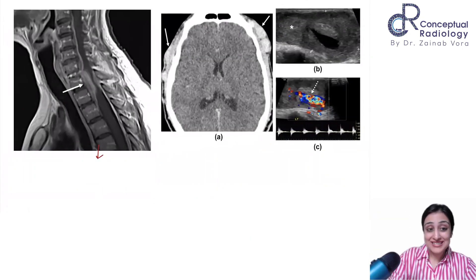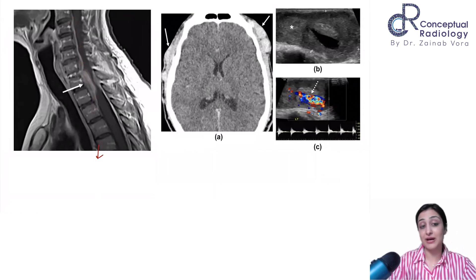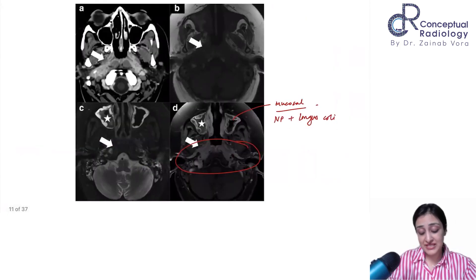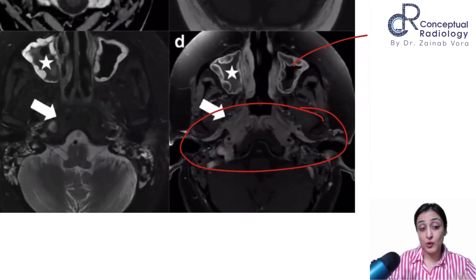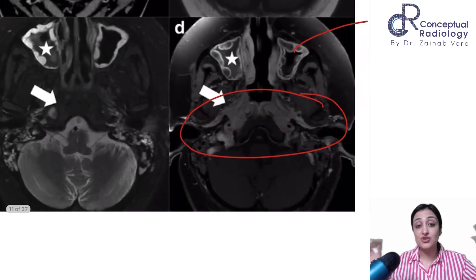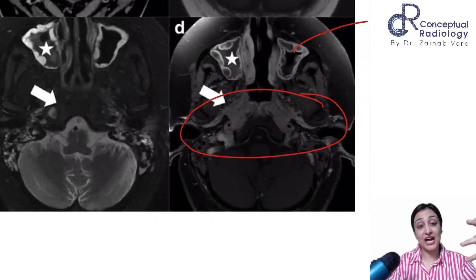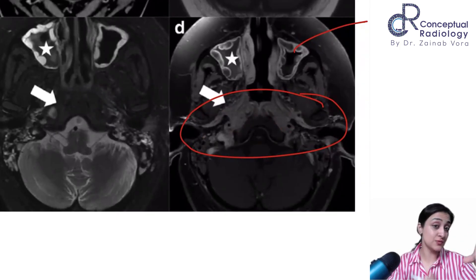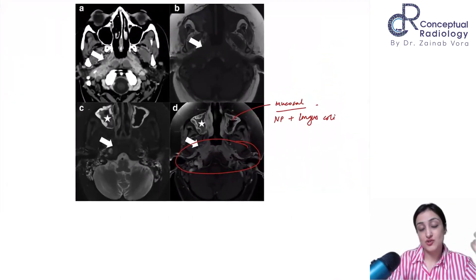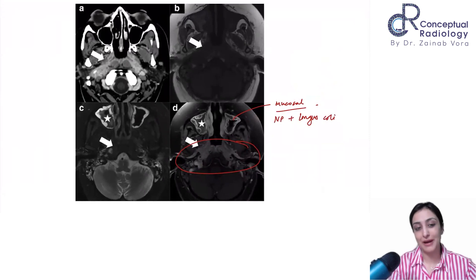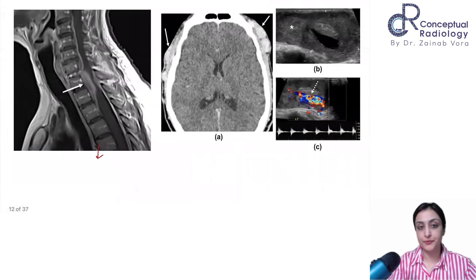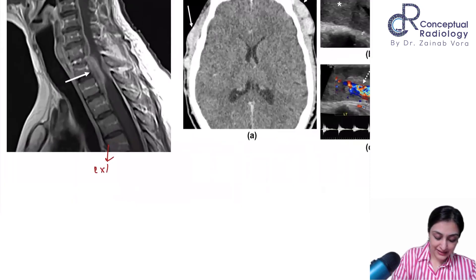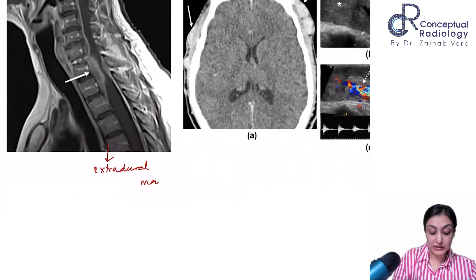Pachymeningeal thickening presenting as an extradural mass causing spinal cord compression. NPC cannot be so symmetrical. Even if bony erosion is present, it is diffusely symmetrical infiltrative soft tissue. A carcinoma would be asymmetric and much more destructive. This is slowly progressive — symmetricity, progression, response to steroids, and IgG4 levels all point to this diagnosis. Biopsy of any one site confirms it.